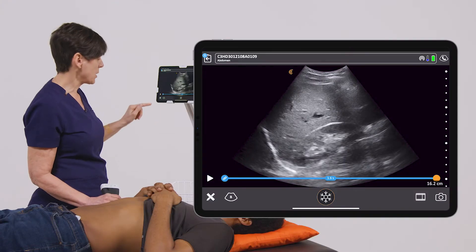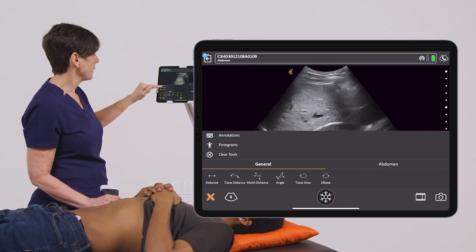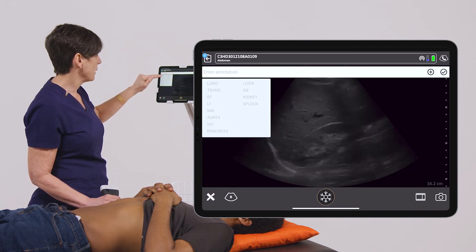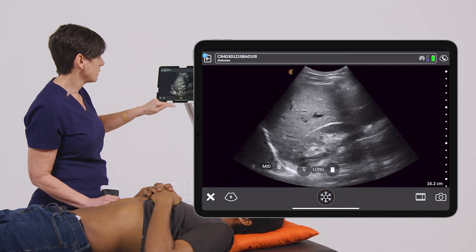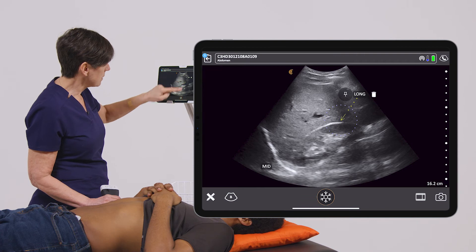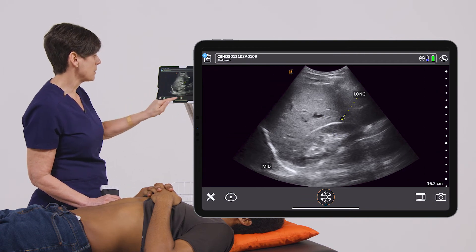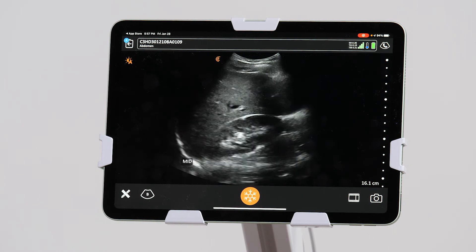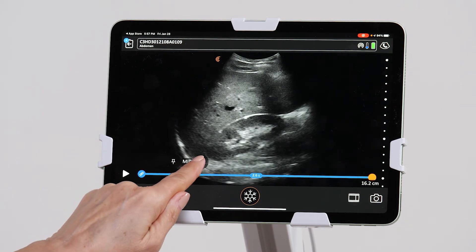Now in the event that you want to put annotations on your image, you click on the tools, then annotations, and add predetermined annotations. You can move them to where you want. You can place a pin that points to the structure that you're looking at, and then take another image. To delete your annotation, simply press on the trash can.